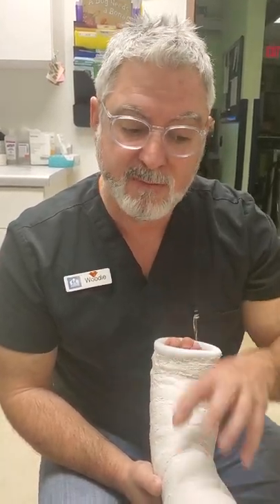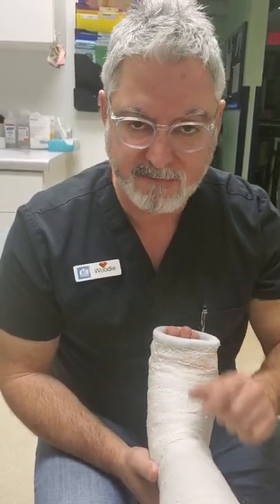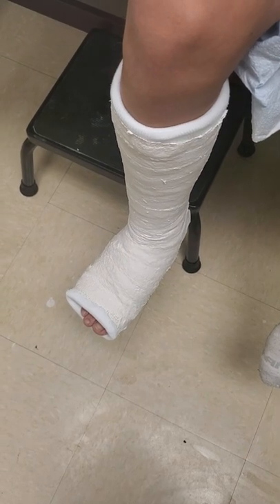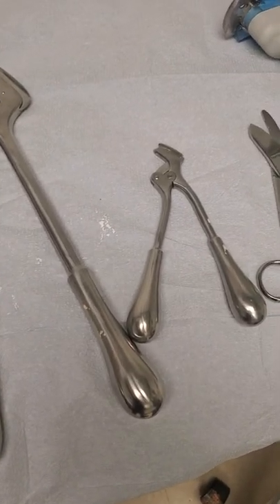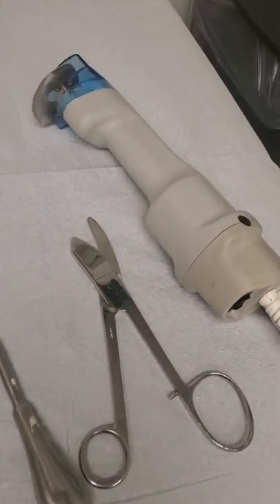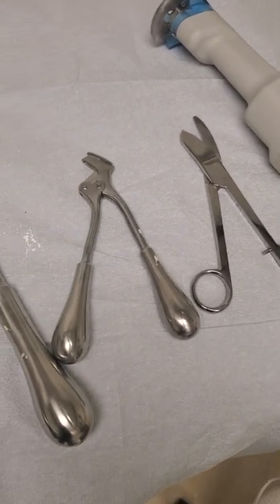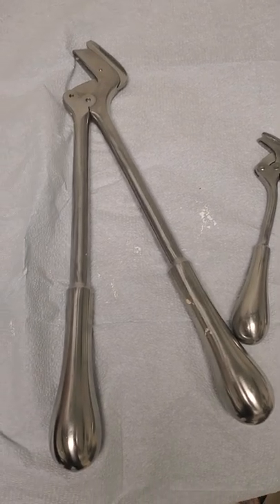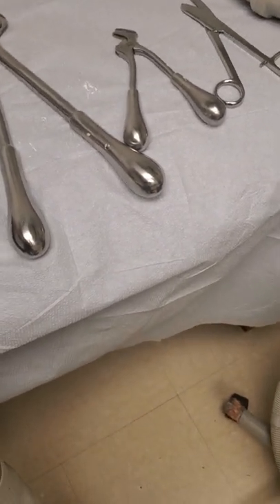Those are some variations on removing a plaster cast versus a fiberglass cast. We're going to pause here, get everything set up, and go ahead and take this cast off. We're getting ready now, and just wanted to show you the different stages of cast removal tools over the years here on the exam table. We're going to be using the cast saw to remove this, but prior to that there have been other types of tools you can use to go through the plaster. Once you've softened the plaster up, they just cruise right through it.